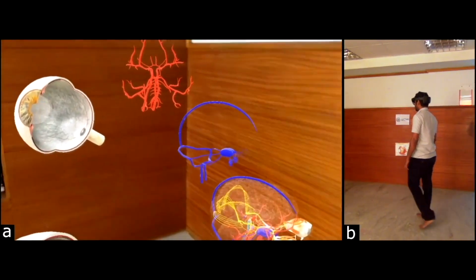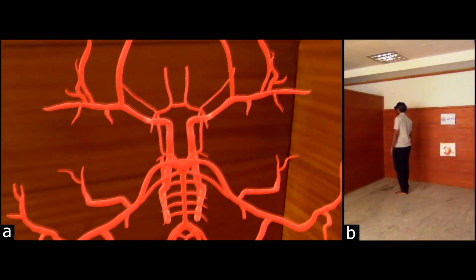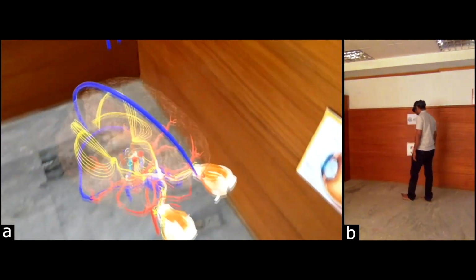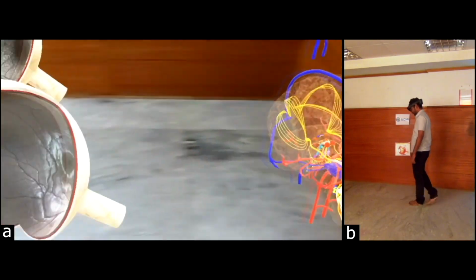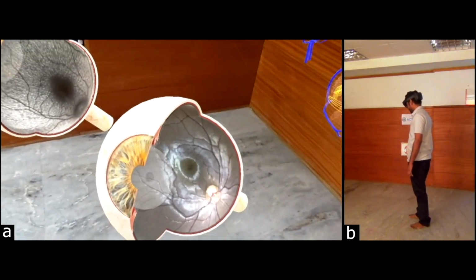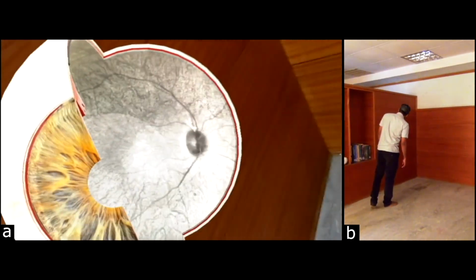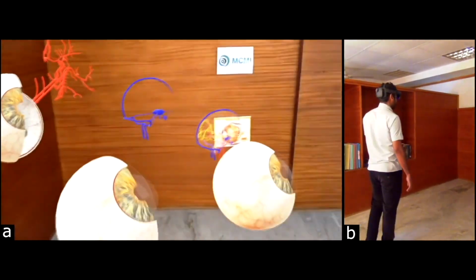In this video, on the right hand side, the doctor seems to be moving in an empty space, but in reality, he is wearing an augmented reality headset through which he can see and access all the patient's 4D case sheets by touch, as shown on the left side video.